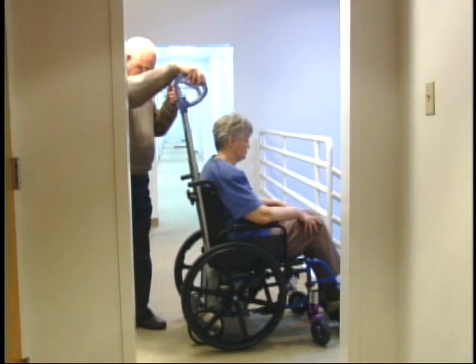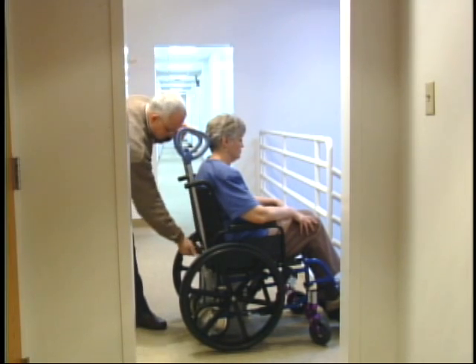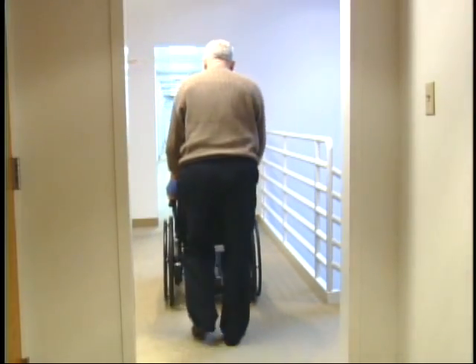Lower the wheelchair to the ground using the Scattermobile and lower the handlebars. Now you can continue on your travels with the Scattermobile still attached to the wheelchair.